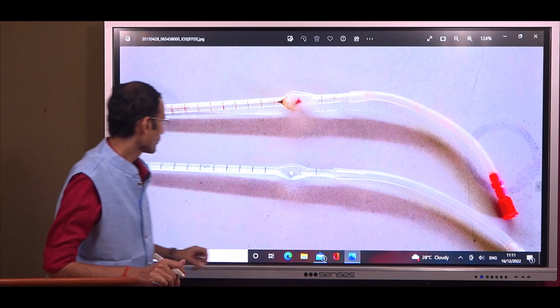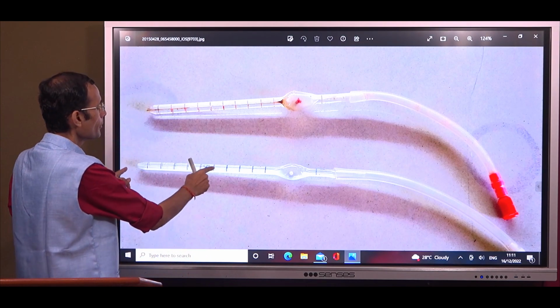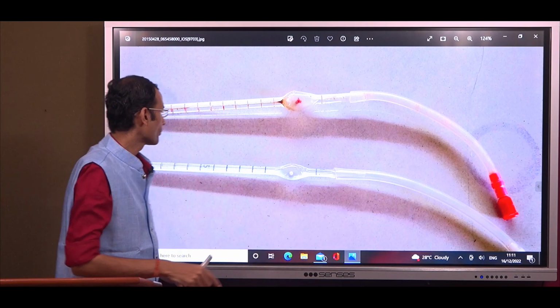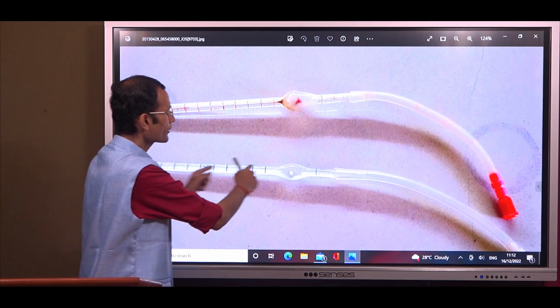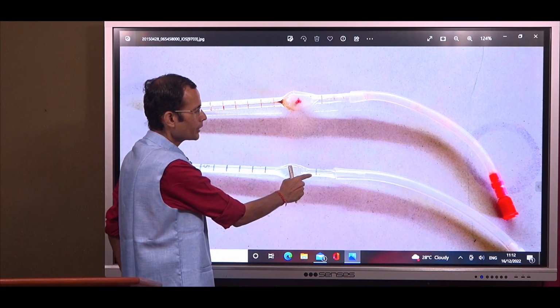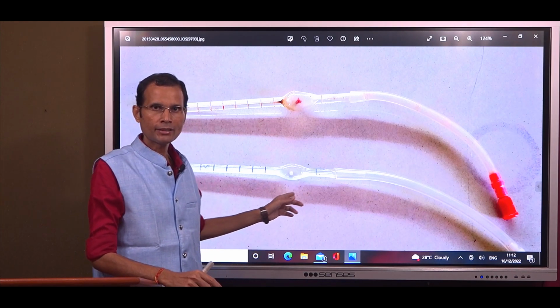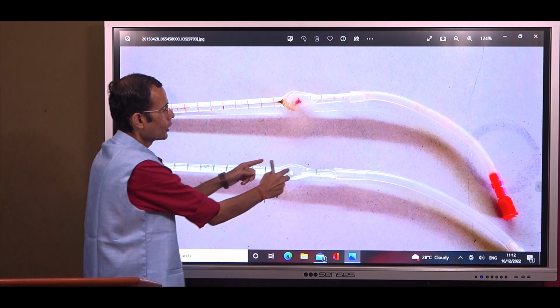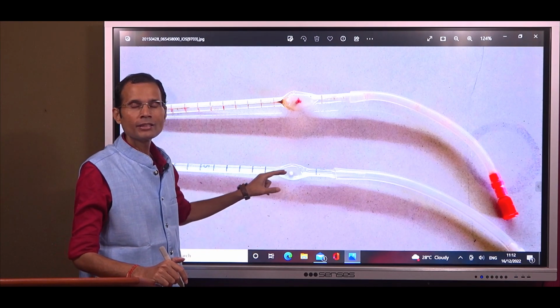In the case of the WBC pipette, take the blood sample up to the 0.5 mark. Now this is easy to understand. Take the blood up to the 0.5 mark, then start taking the diluting fluid. The blood sample goes in the bulb, the diluting fluid starts going into the bulb. Fill it until it reaches the 11 mark in this case. That means now the blood sample and the diluting fluid are entirely within this bulb.